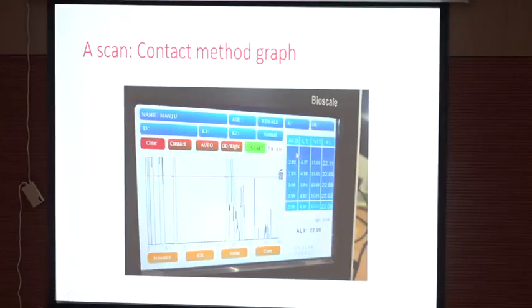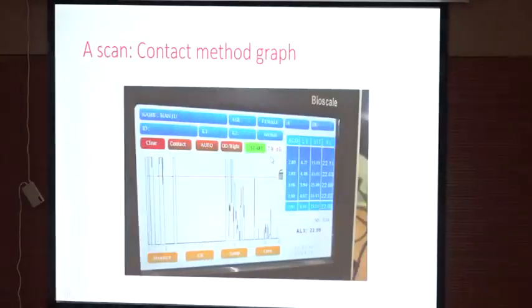Besides this, we also get data of anterior chamber depth, the lens thickness, and also the vitreous cavity length from the A scan. The axial length can be displayed here. The IOL power can then be calculated by the different options available. The gain can also be increased according to the media or the density of the cataract.